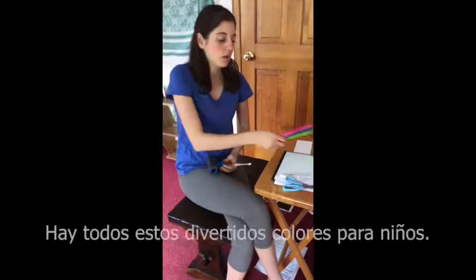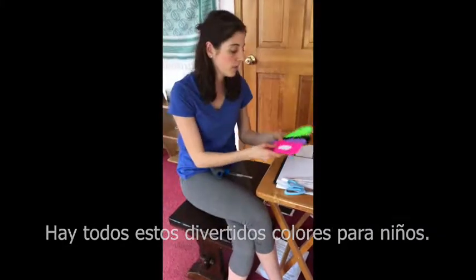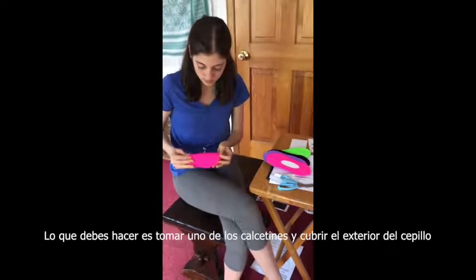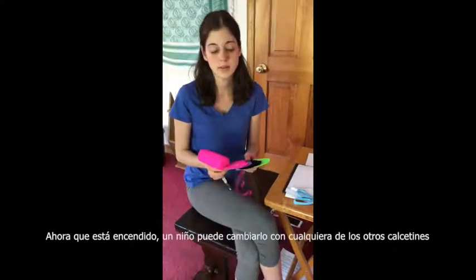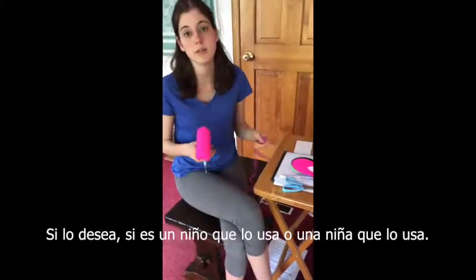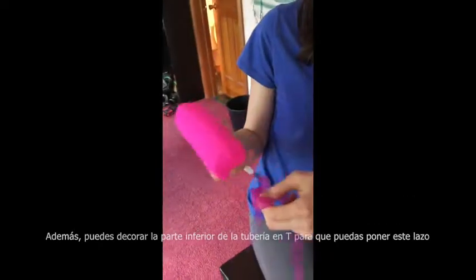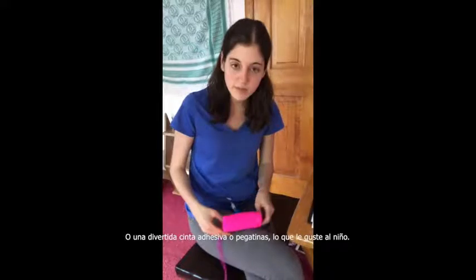To cover the outside and make it cosmetically appealing, we found colorful socks in all different fun colors for kids. You take one sock and cover the outside of the brush so it stays together. A kid can swap it with any of the other socks depending on their preference, and you can also decorate the bottom of the T-pipe with a bow, fun duct tape, stickers — whatever the kid likes.